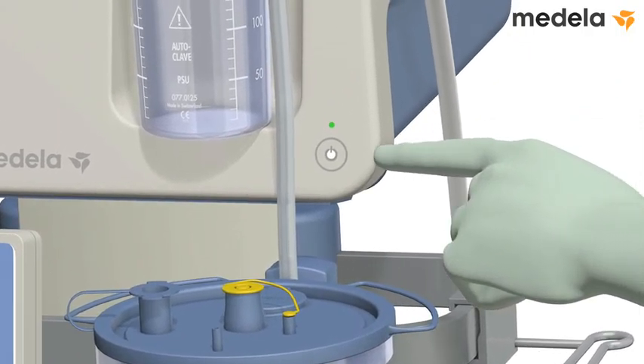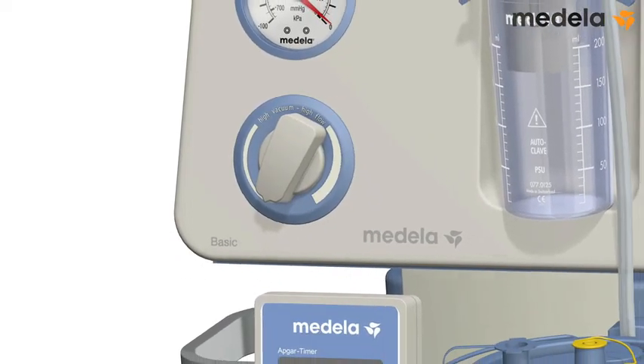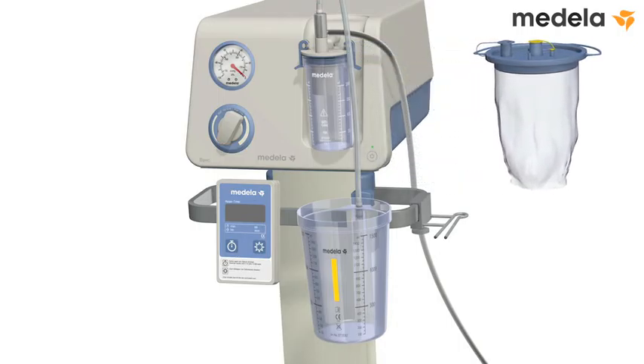Turn off the pump. Turn the vacuum regulator fully counterclockwise to set the vacuum level to zero. Remove the disposable liner and discard it according to hospital policy.